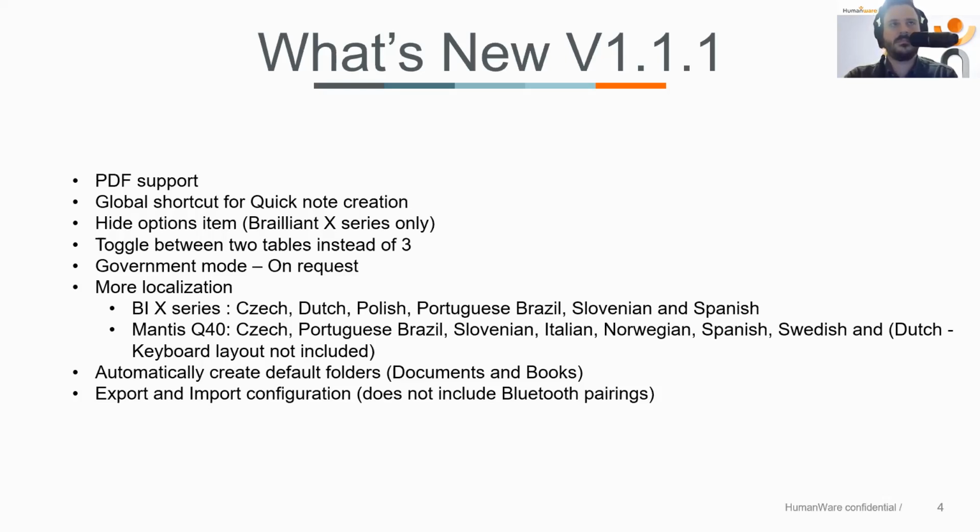But it's a great way, if your device ever needs to go in for repair for whatever reason, to export your Wi-Fi configurations and then import them into maybe a loan unit. So perhaps you've taken advantage of the care plan program. You can then import the Wi-Fi configurations back to the loan unit.